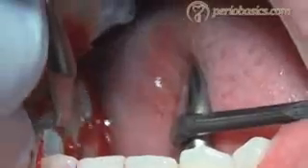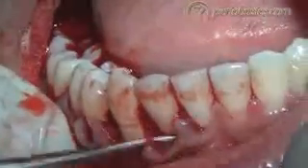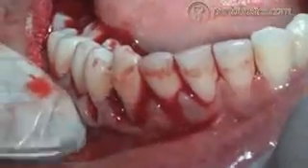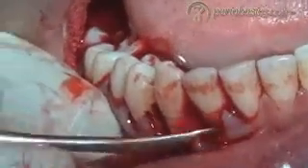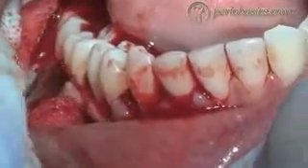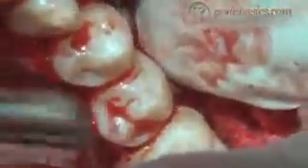In the posterior areas we can use blade 12D, and then we reflect the flap. So first of all we reflect the interdental papillae, and in the same way we reflect the flap on the lingual aspect. It is important to expose the marginal bone so that we can access the bone defects, but overexposure is not recommended.